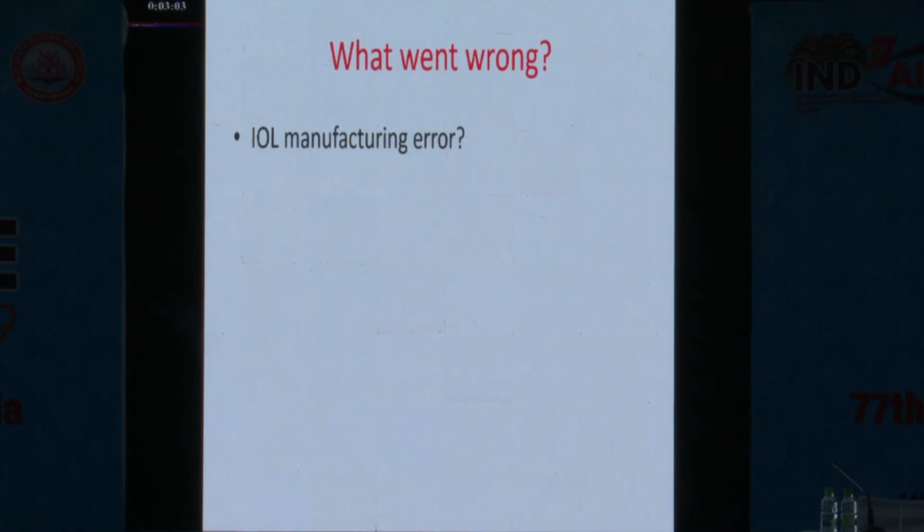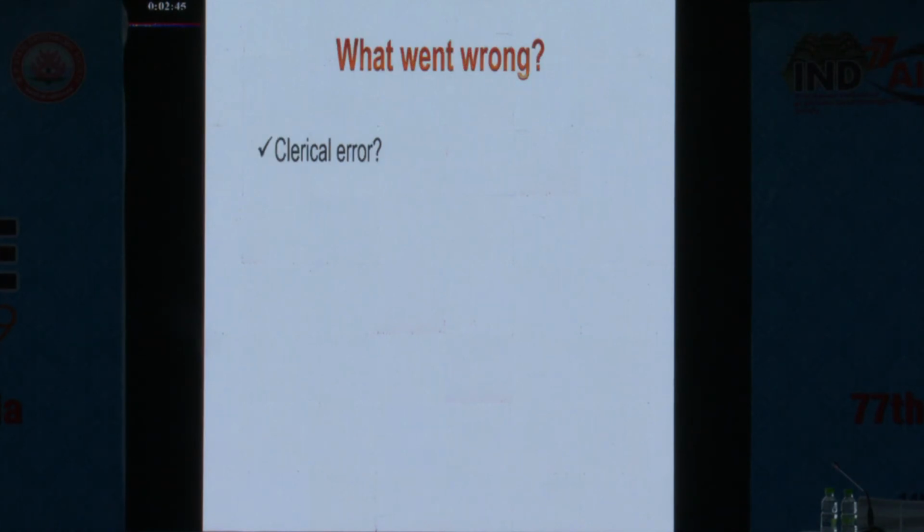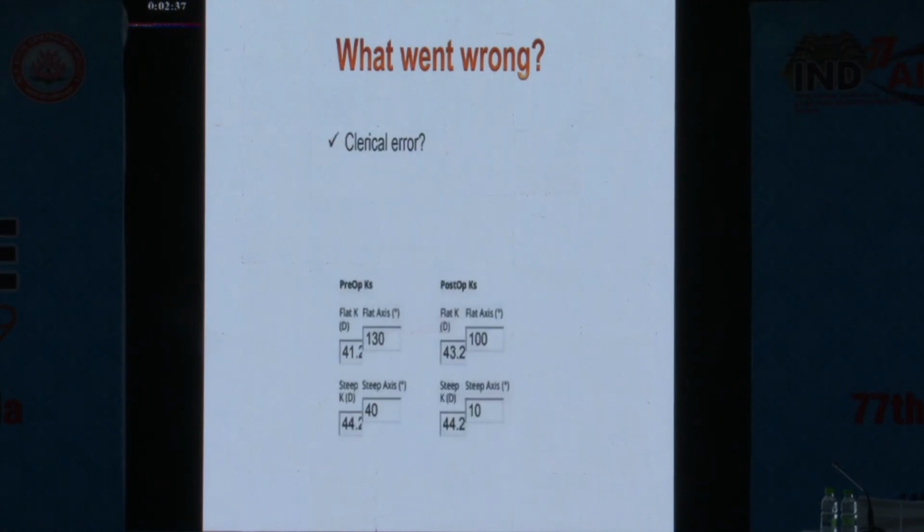See, were we supplied a wrong IOL? Imagining that your all calculation and everything is proper, IOL is aligned properly, did we supply a wrong IOL? Or was there a clerical error? Did the optometrist enter the measured K reading wrongly? So probably this is what happened.